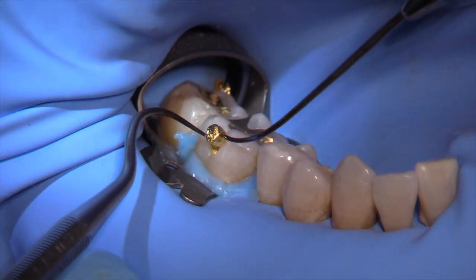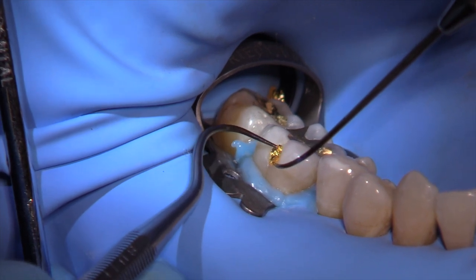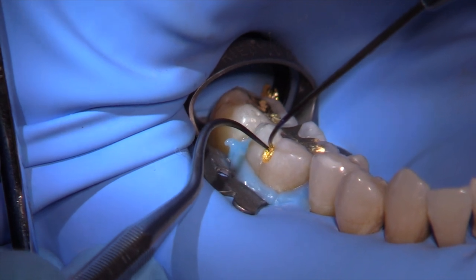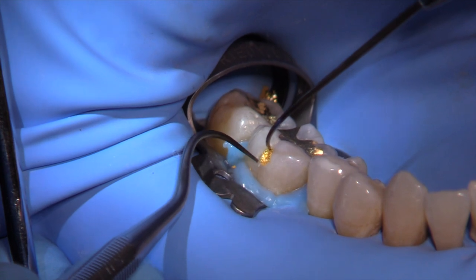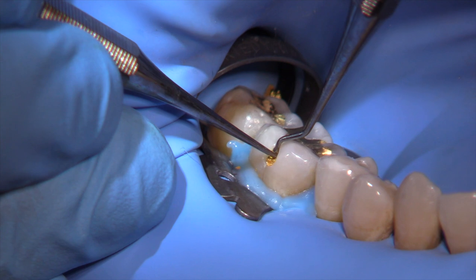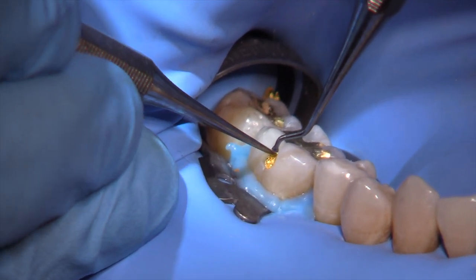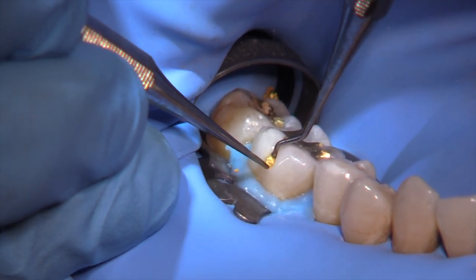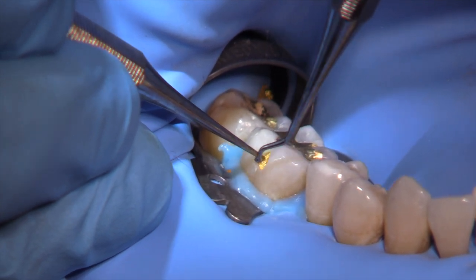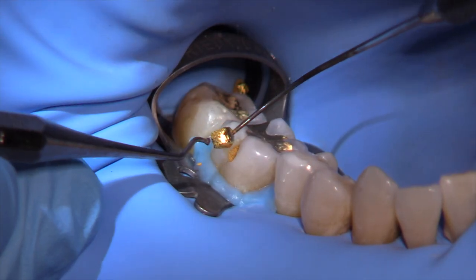After flaming the easy gold, we pass it into the cavity with the Woodbury-Myers holding instrument, which is good for placing but not condensing. Notice this is definitely a four-handed dentistry procedure — Millie is flaming the gold and bringing it to the cavity while I work on condensation. I'm using a Farrier number one condenser; Millie is tapping the end of the instrument with a special mallet while I position the tip precisely where I want it. She times the mallet blows so she's hitting when I'm pushing against the foil. It takes practice to get the timing right. An electro mallet — no longer made — was a nice invention that allowed you to work without an assistant malleting.